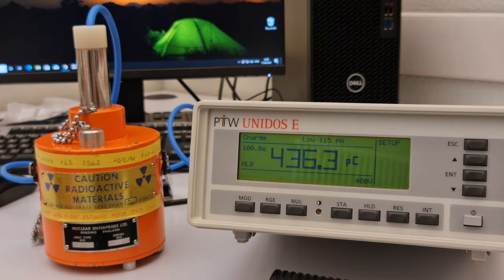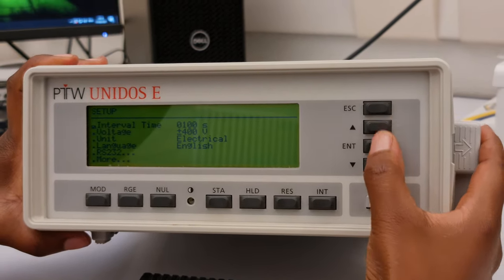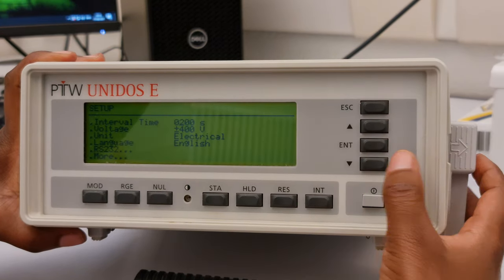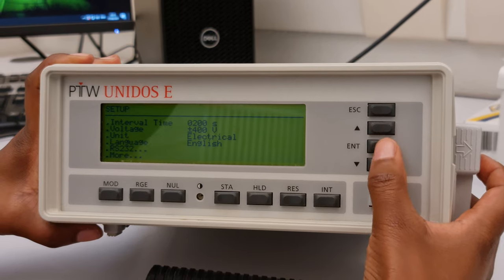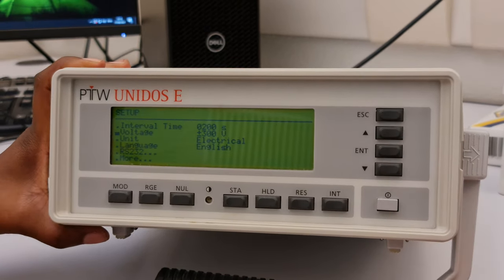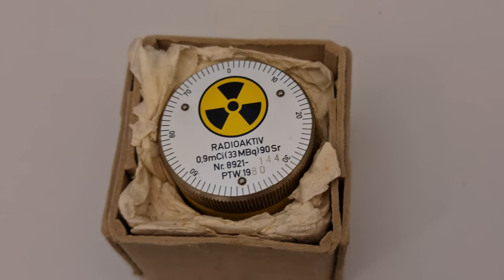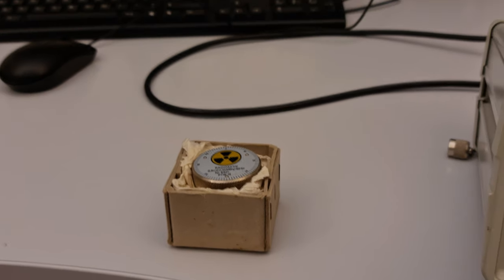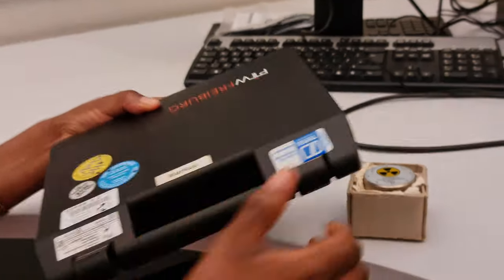Moving on to the next detector, which is a plane parallel chamber — in our case the Advanced Markus. We set the electrometer, the interval time, the voltage, and then we are ready to take the measurements. The radioactive source we are using is still Strontium-90, just of a different shape, and the detector is the Advanced Markus.